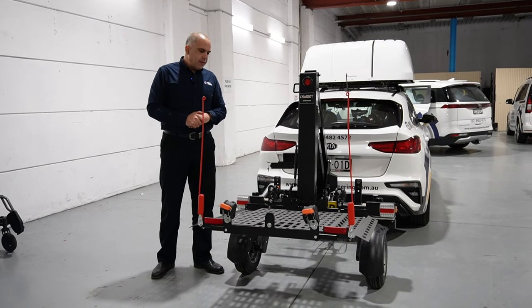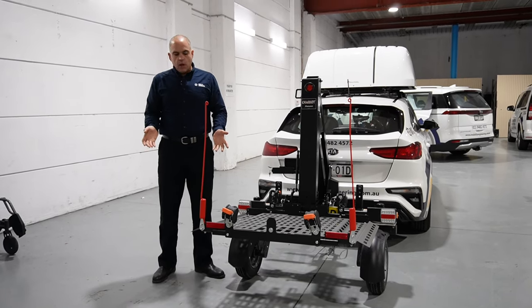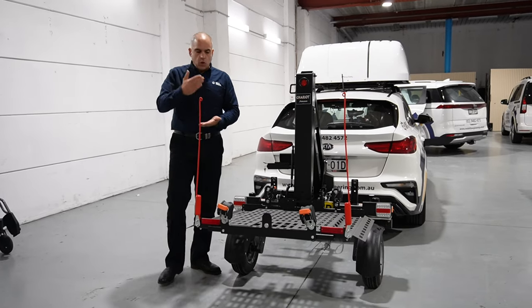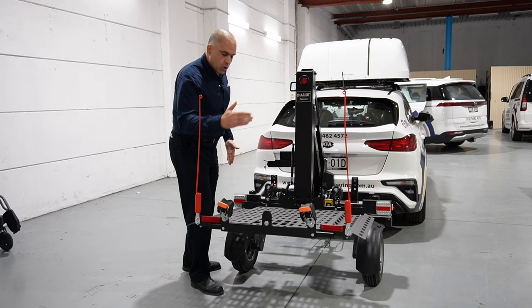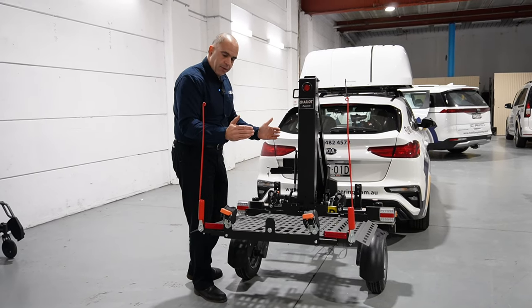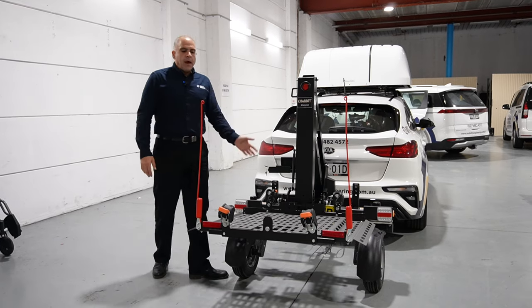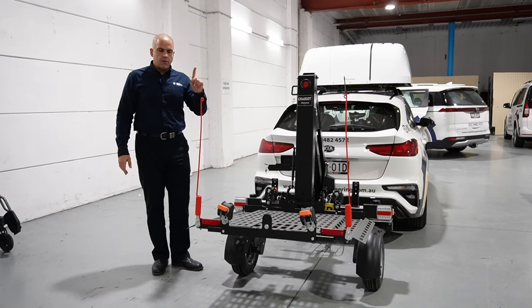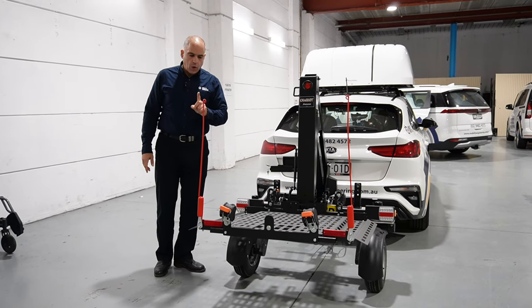The long and short of it is: can I replace the platform on the Bruno Chariot with a solid platform? The answer is unfortunately you cannot. You can do things to protect your wheelchair or scooter from underneath — perhaps a protection barrier or some kind of cover — but we cannot change this platform.